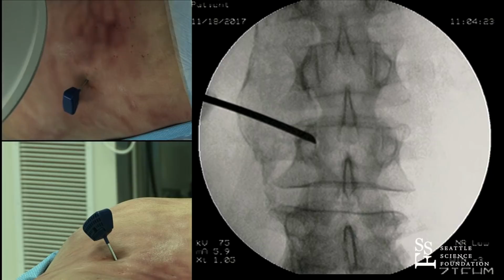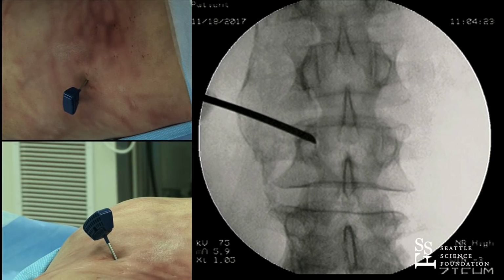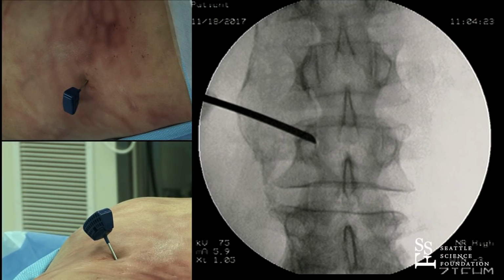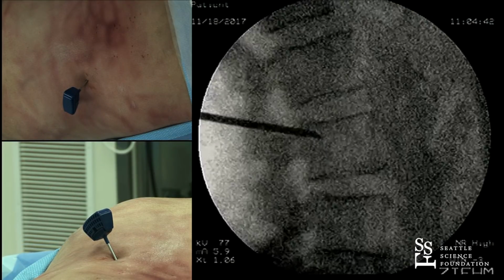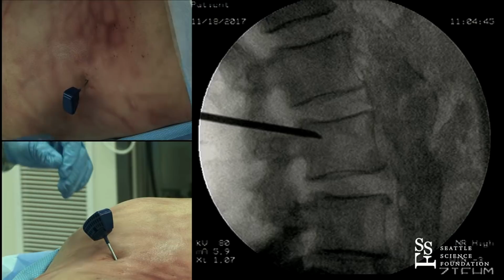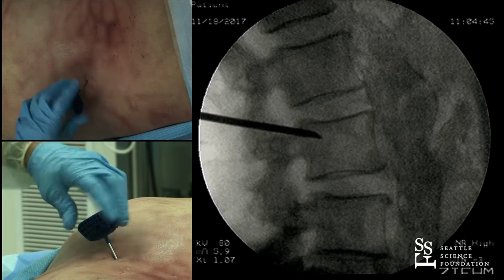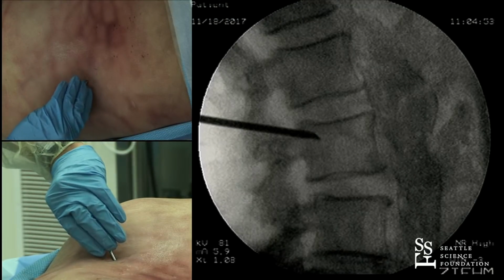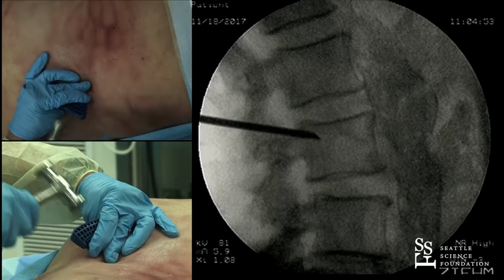Does everyone understand why that is? The whole audience, I think that is one of the biggest points in teaching this: check your lateral at this point, making sure you're not transgressing. So that's a very decent approach. So if we adjust this, we send it more toward the center of the vertebral body.